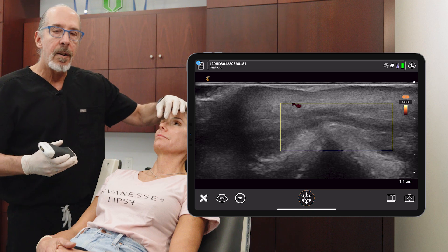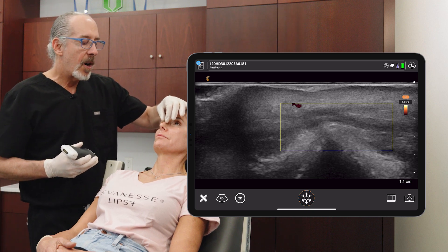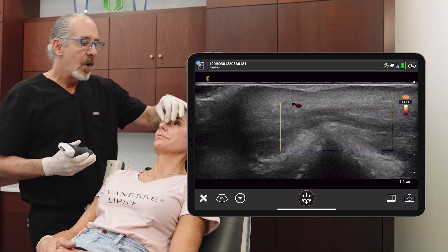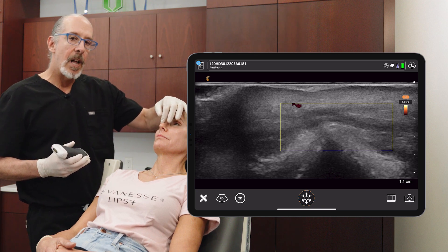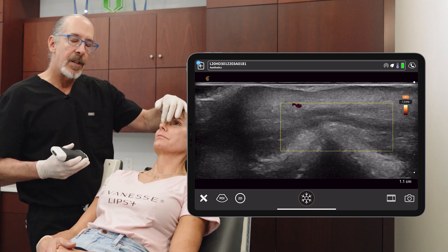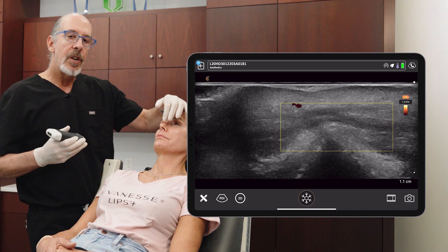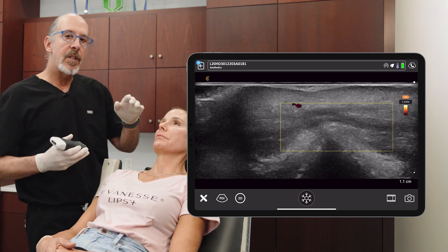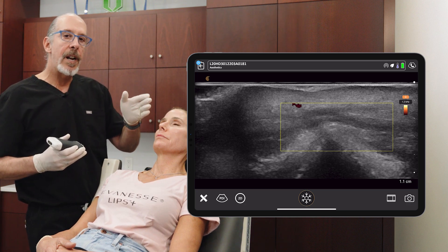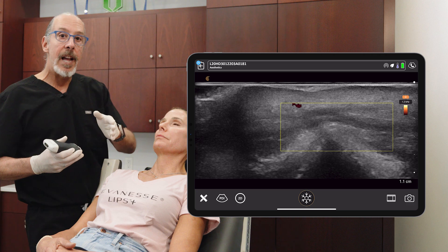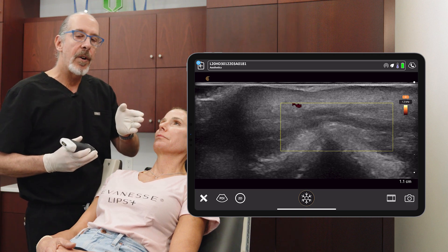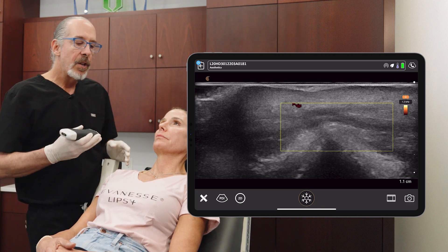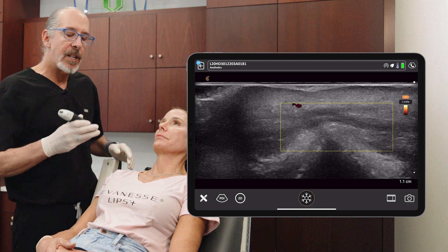The other pertinent vessels are the dorsal nasal vessels, which usually run paramedian, but often they cross the midline, and often they're communicating branches. You really have to evaluate the nose in several spots to get your anatomy and to get the layer, because hopefully it's not along the bone and it's not in the midline.